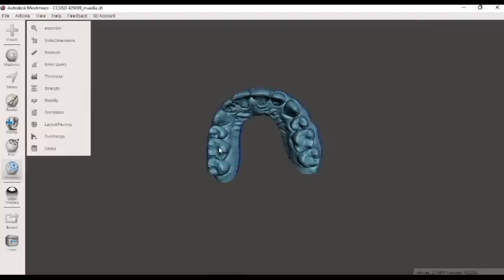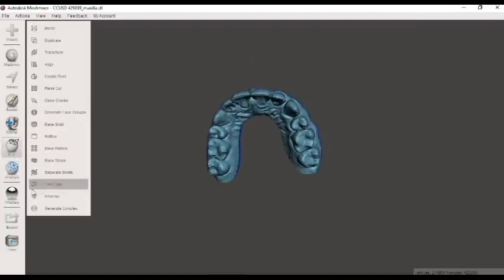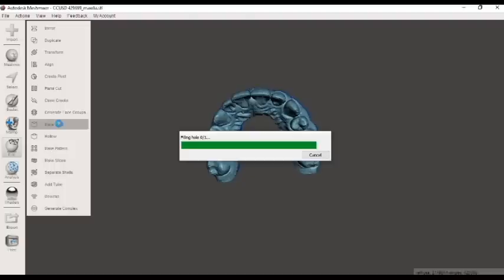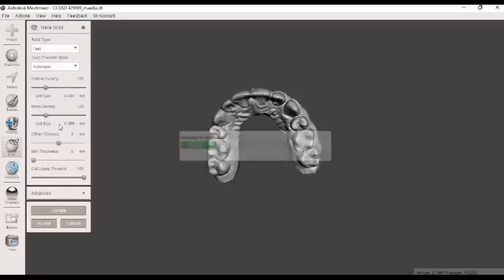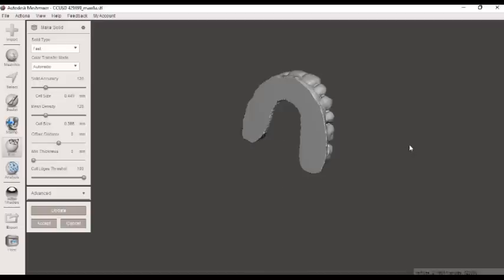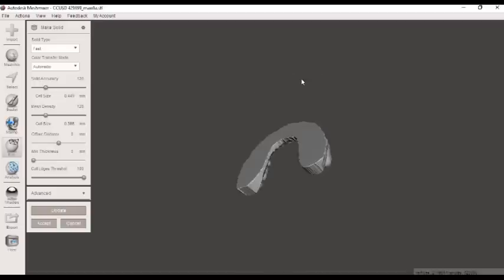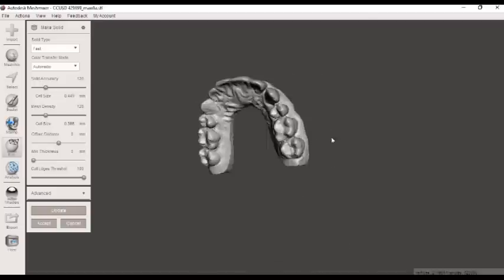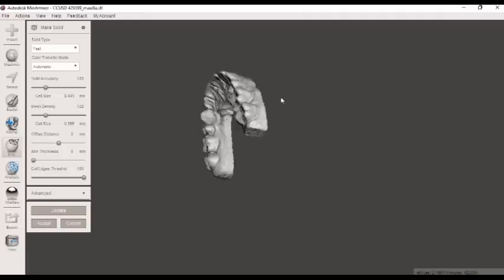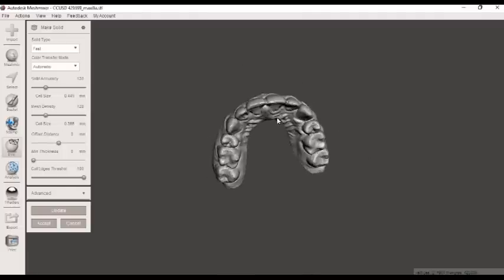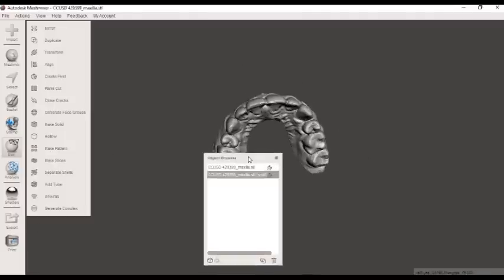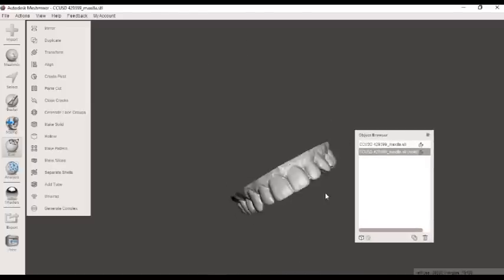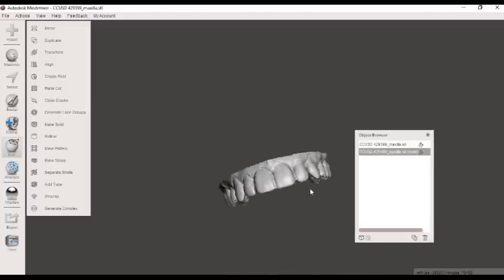And again, come over here to our edit key and select make solid. You want it to say filling hole of one. If it says filling hole of six or filling hole of 10, you did not use your inspector key. We only want one hole to be filled here. And sometimes it takes a while. Excellent. Here we go. Take a look at that. Awesome. Now before you export, make sure you accept this here. And now it's ready to be printed.